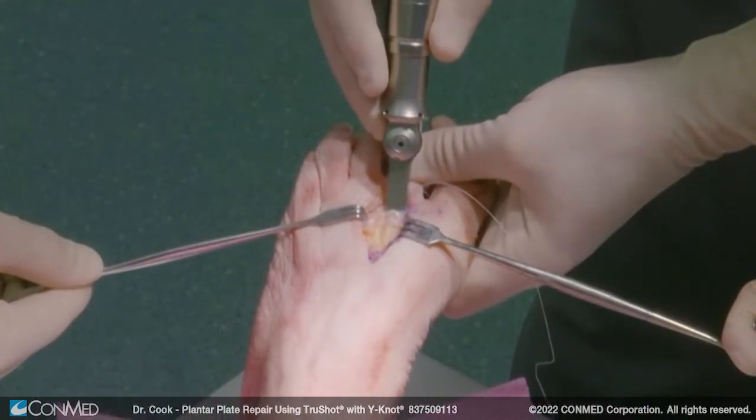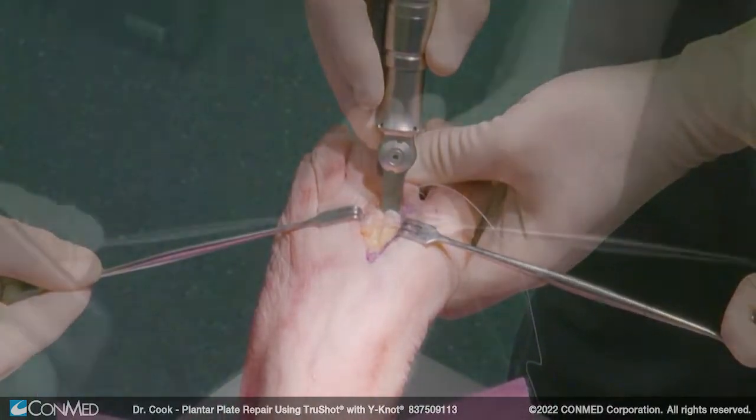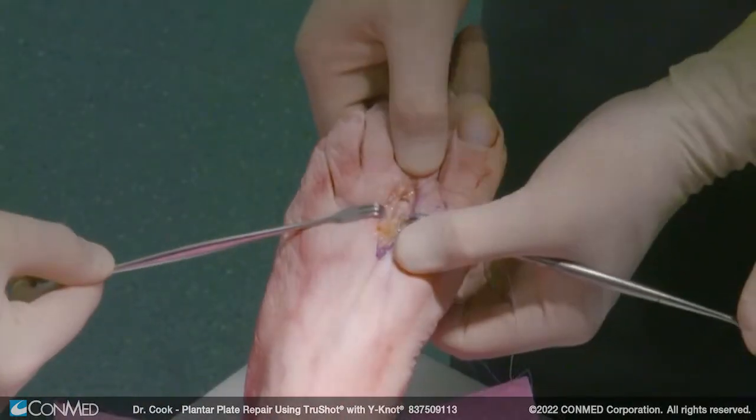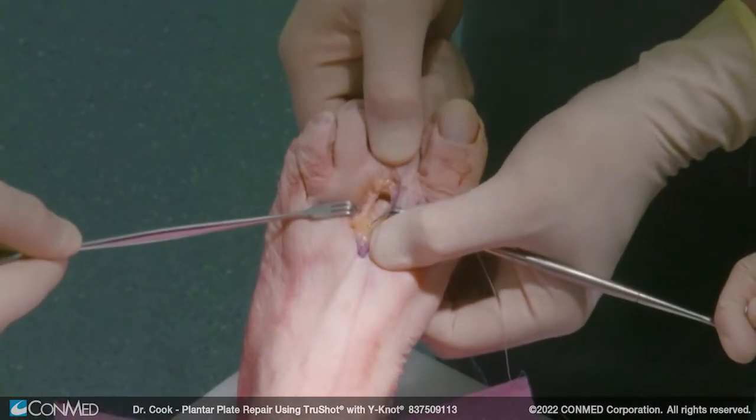I use the Hall Micro Free Sagittal Saw. Now we have the shortening done, and just to show you — we're very unstable at this point.